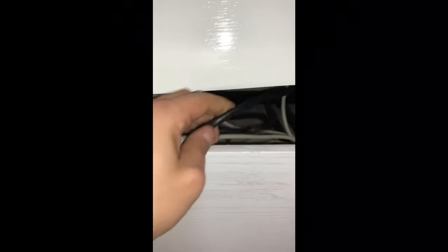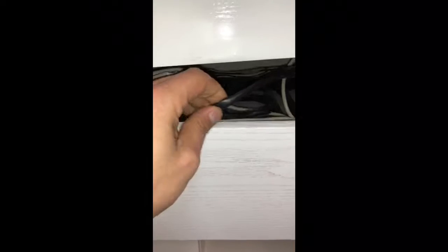So what we're gonna do is we're gonna go ahead and trace it, and that wire from the top, it's coming all the way to the bottom of the cushion of the bed, and that wire, it's this one right over here. Once this is found, it's gonna be inside of a box, which the box needs to be taken out.